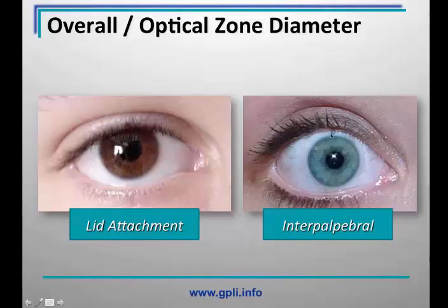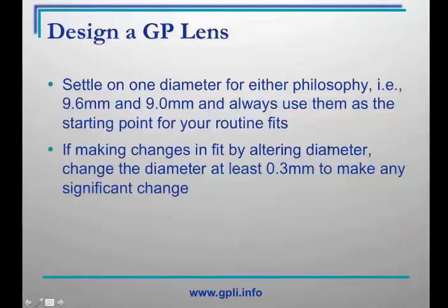But settle on one diameter for either philosophy, and that will be a starting point for your routine fits. But remember, if you're making changes in fit by altering the diameter, change that diameter by at least 0.3 millimeters to make any significant change in the fitting relationship.